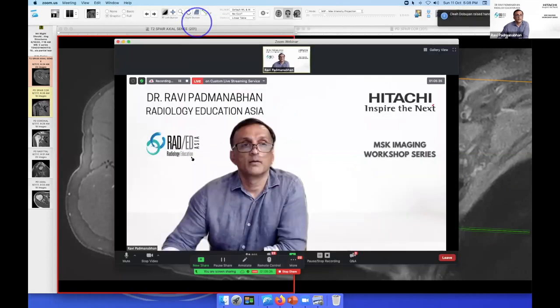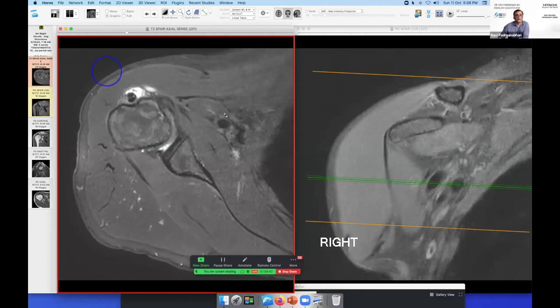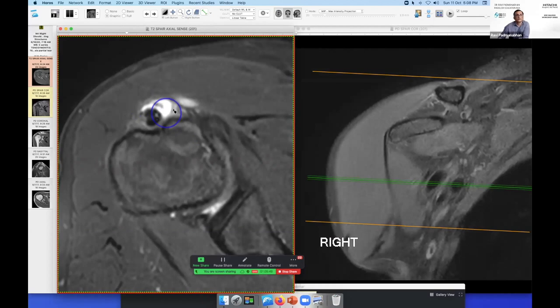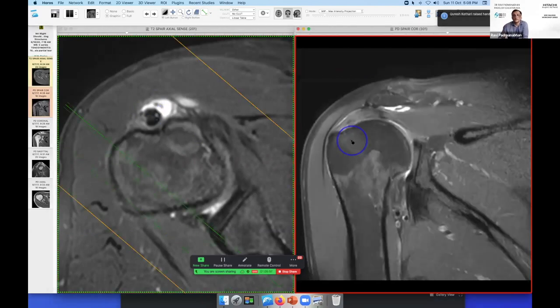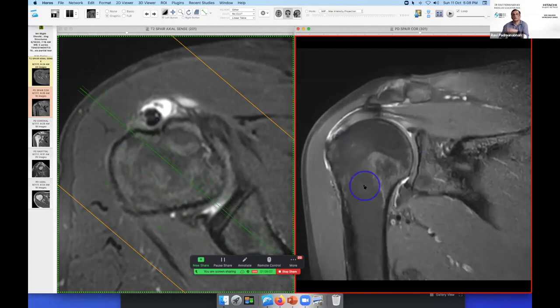Let's look at a different case — another patient with tendinosis and tenosynovitis. We've got increased fluid within the tendon sheath — more than you would expect, though there's no specific measurement; it's subjective. You need to go and look at the joint space: is there a joint effusion? There's no joint effusion here, so it's not that fluid from the joint is coming down into the tendon sheath. So we do have increased fluid in keeping with tenosynovitis.